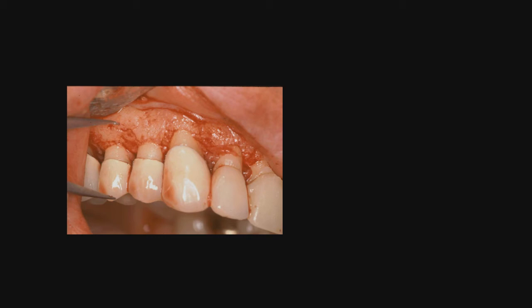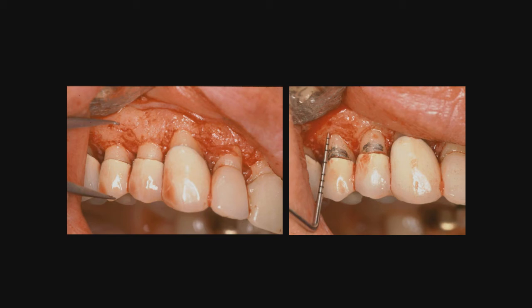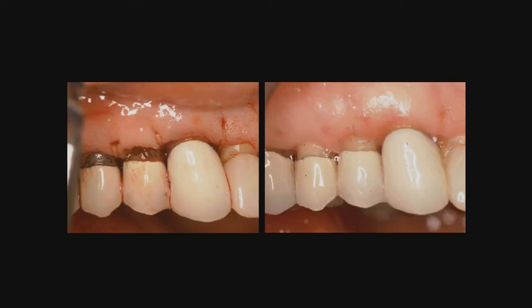This is one of my more effective images. You will see those premolars, which are supposed to be 9 millimeters long, and how much bone we're going to have to remove on the facial to get that 9 millimeter length. At surgery, you can see the pencil marks indicating the ultimate crown margin, and after doing the crown lengthening we have 3 millimeters biologic width apical to where the crown margin will be. About 3 or 4 weeks later, you can see where the tissue margin has healed and we have exactly the margin we want.